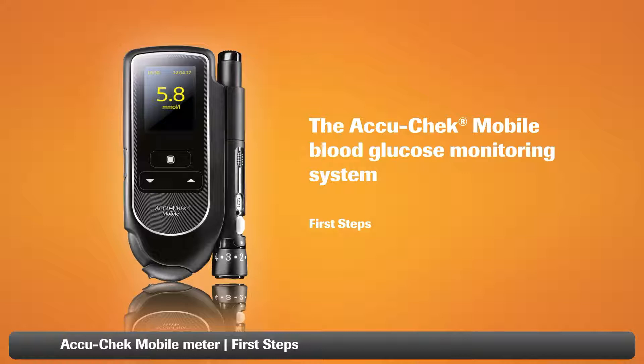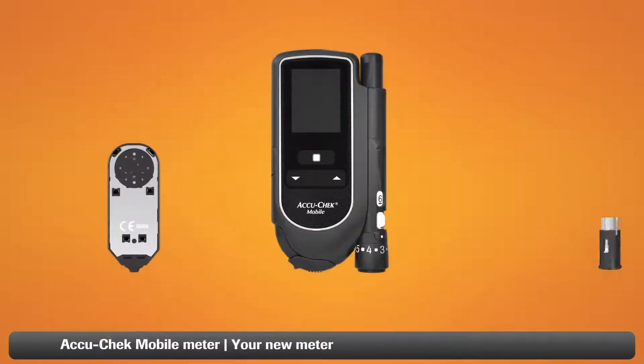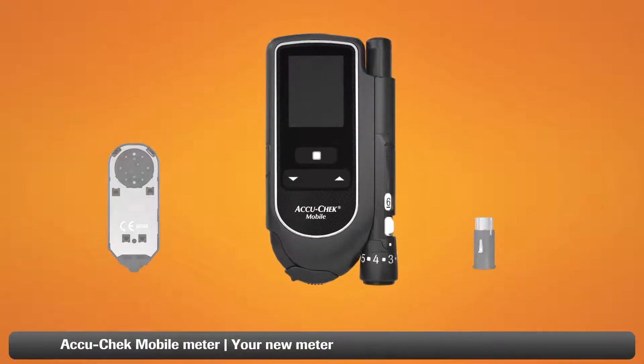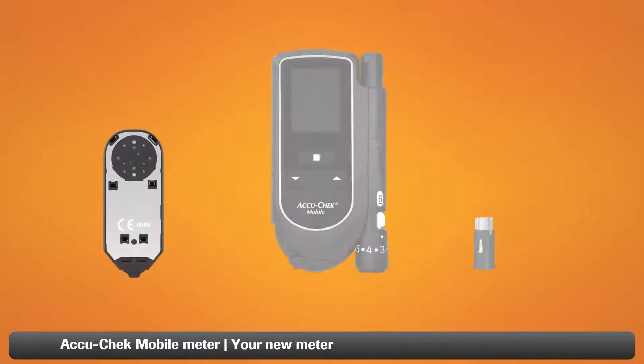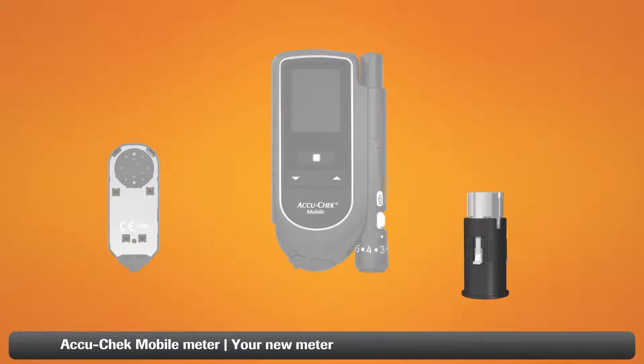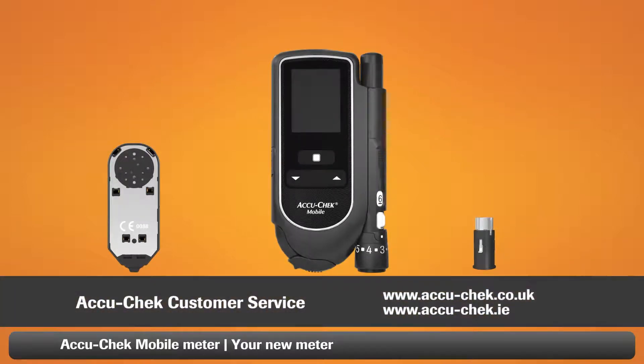This video will show you how to set up your AccuCheck mobile blood glucose monitoring system. The first thing to do is make sure that you have everything you need. You should have the following items: the AccuCheck mobile system with an attached AccuCheck FastClicks lancing device, an AccuCheck mobile test cassette, and an AccuCheck FastClicks lancet drum. If you can't find something or need assistance, just contact AccuCheck customer service.